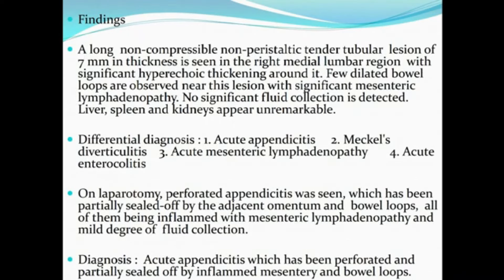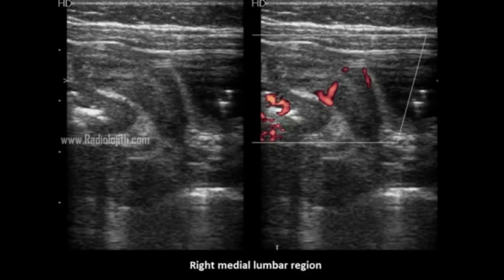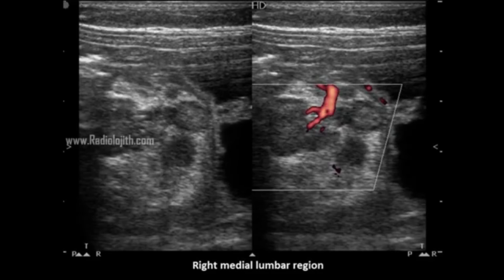The differential diagnosis for these findings could be: first, acute appendicitis; second, Meckel's diverticulitis; third, acute mesenteric lymphadenitis; fourth, acute enterocolitis. This is an infant — almost 8 months old — so the differential diagnosis was either appendicitis, Meckel's diverticulitis, mesenteric lymphadenitis, or enterocolitis based on the ultrasound findings.